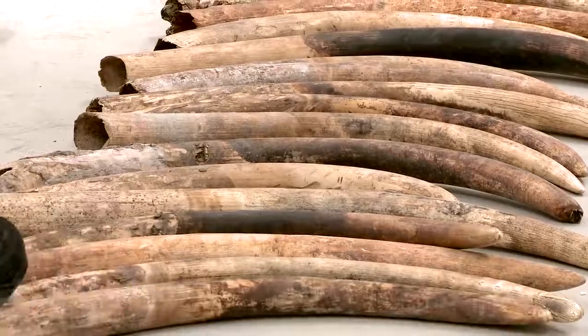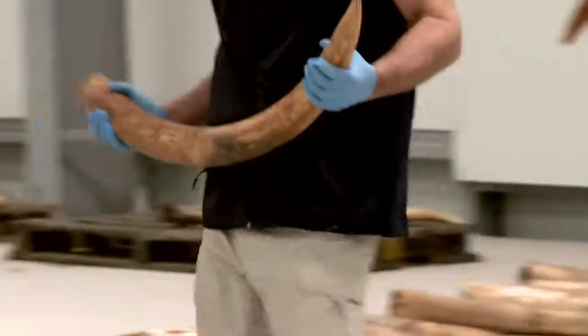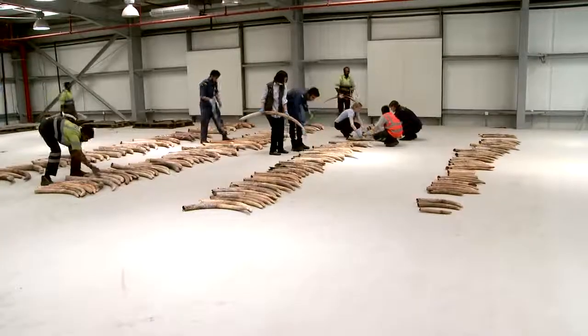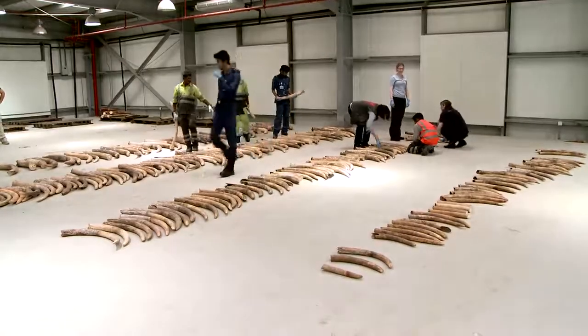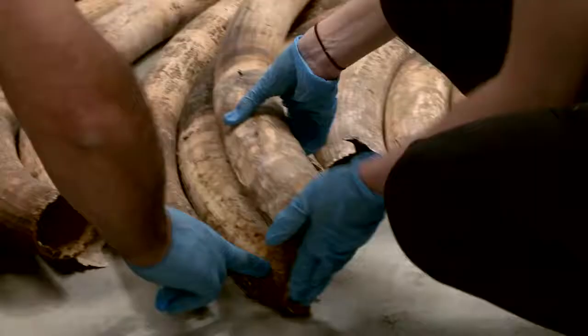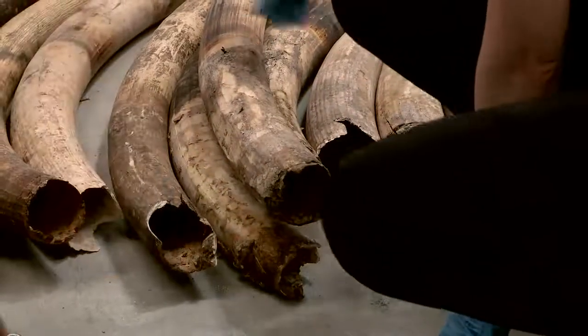Include any other useful information or details about the seizure, such as how the ivory was discovered and how it was hidden. Next, record the date and location at which the sampling takes place, and the name and contact details of the person recording the information. In case there are any questions afterwards, the scientist will know who to contact.